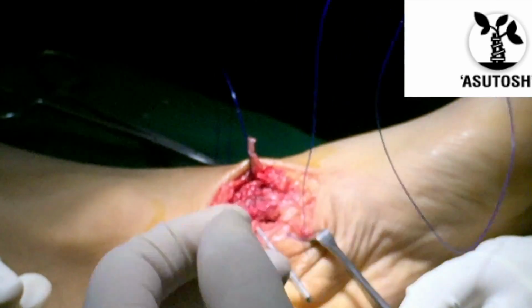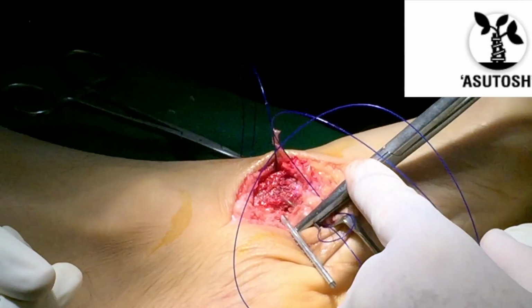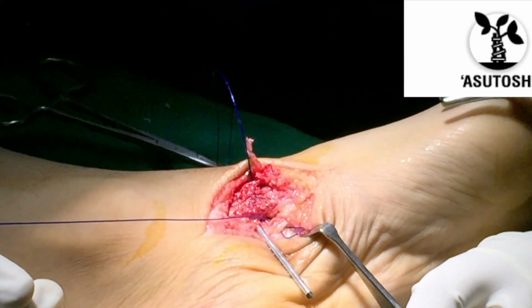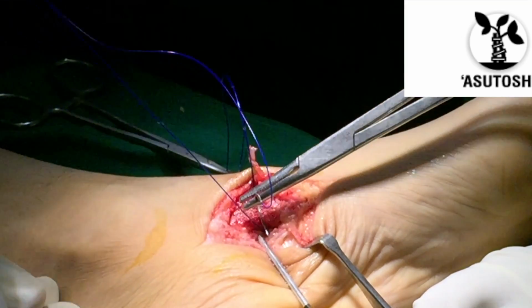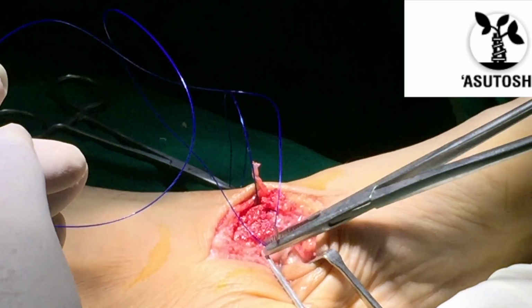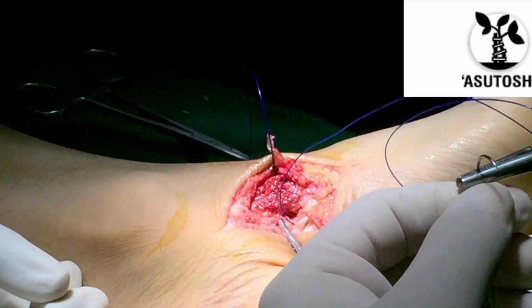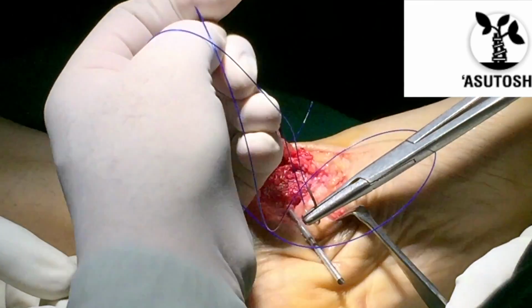We have taken a bite of the suture material into the dorsal of the plantar surface of the posterior tibial tendon, and a reverse bite again into the tendon. We have clamped the other end with a mosquito. So now we have decided to take another bite and probably another reverse bite. And then we would finally pass the suture material into the first hole.